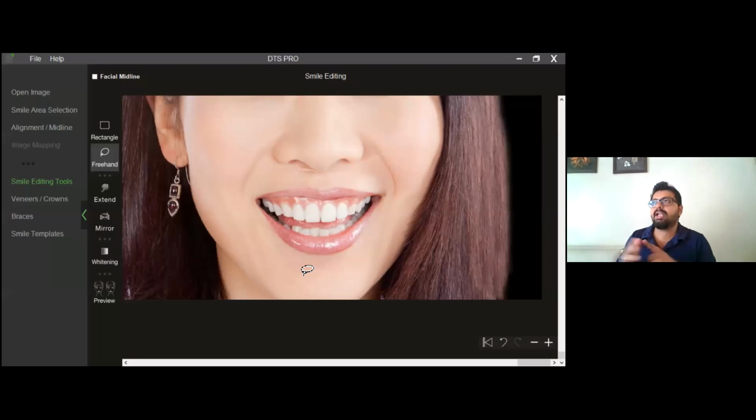With an engine, it only gives you a fixed result. I mean, you cannot change, you cannot whiten teeth, for example, you cannot move each and every tooth. So an engine definitely goes a long way as far as quick motivation is concerned. But when you want a little more controlled simulation to be done, for that you definitely need to go ahead with certain softwares. Let me quickly take a couple of questions and then I'll just continue.